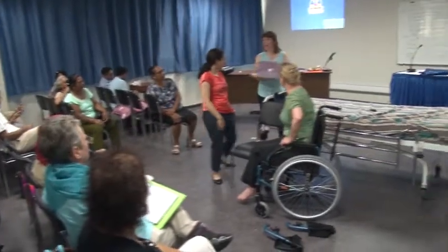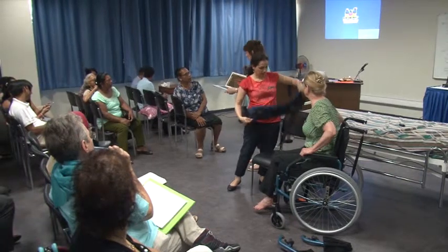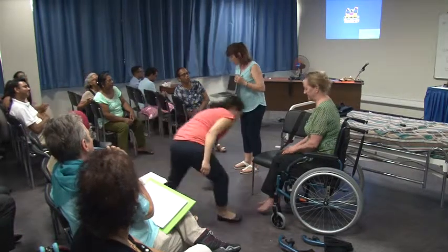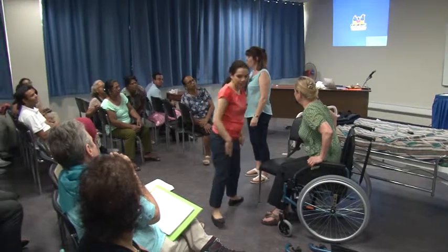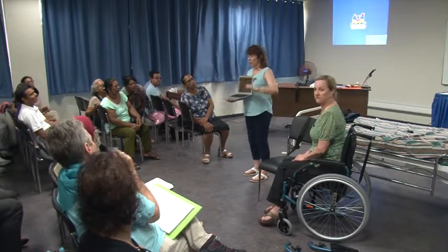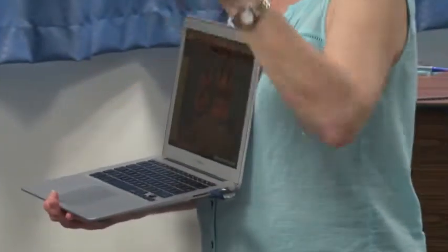The lifting goes. So we were talking about patients that have short arms. I was saying about us ladies with little arms. So we get these made by a charity in the UK because they're better than anything we can buy commercially. You can buy commercial ones, but we hate them. These are lovely. They make them for any size. The little handles, we have all different heights, and they have that rubber on the bottom that doesn't slide.